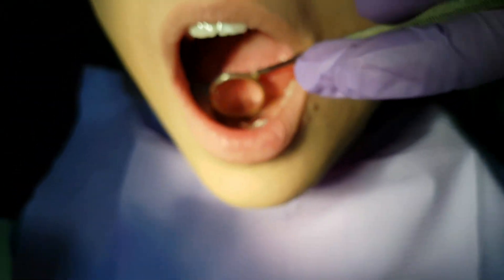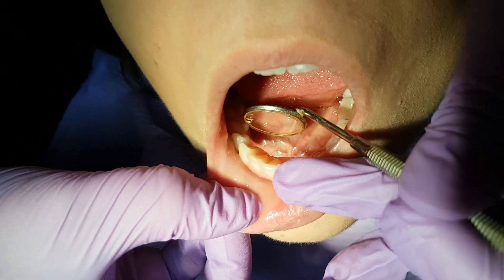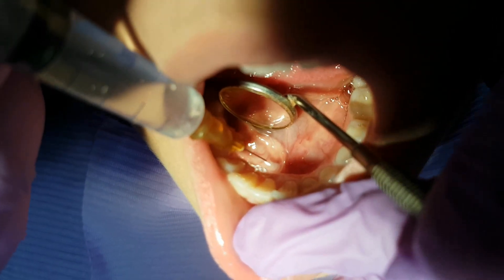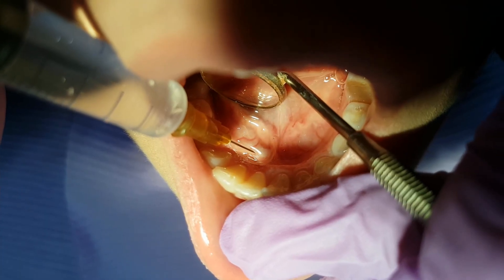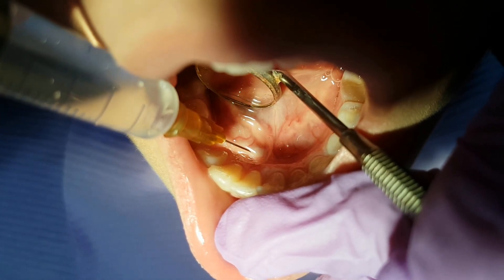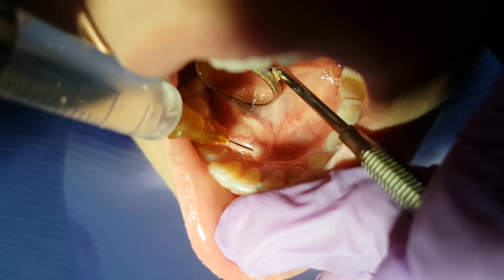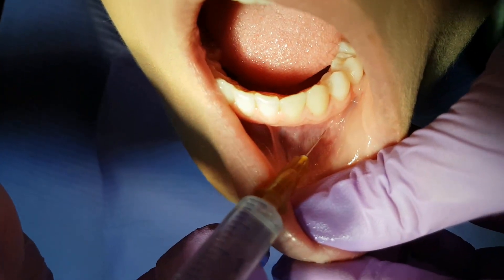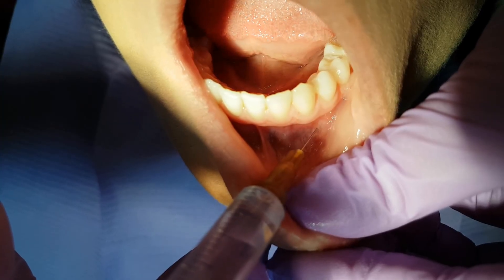We use the same technique in the lingual part of the tooth. Now we will show you how the application of this technique is used in the other part of the jaw.